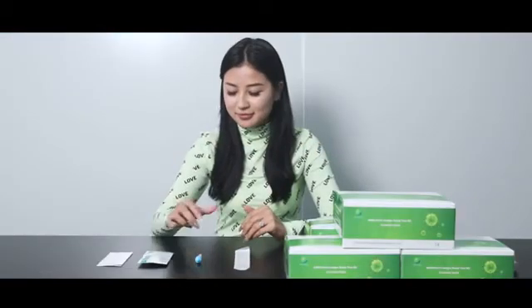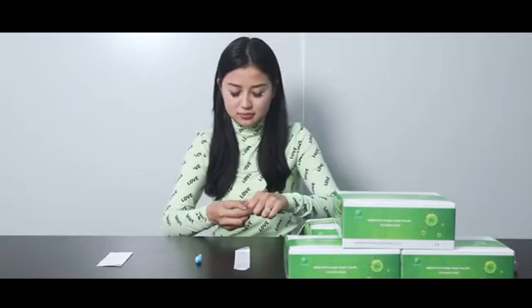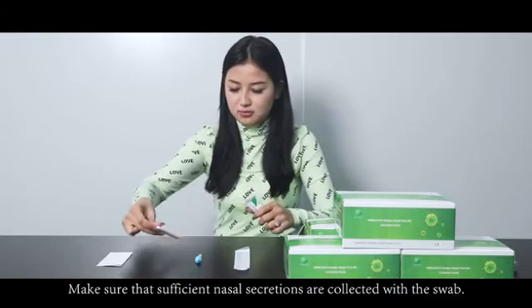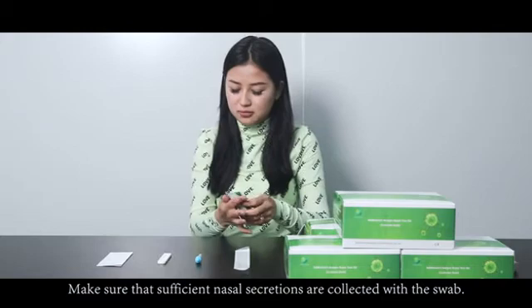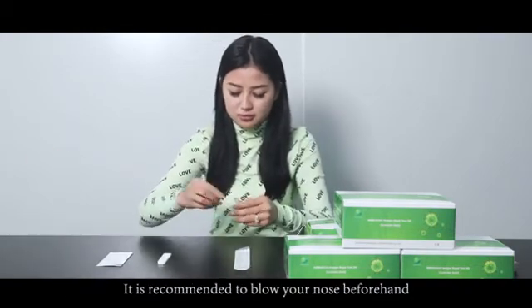Anterior nasal specimen collection. Read the manual carefully before use. Make sure sufficient nasal secretions are collected with the swab. It is recommended to blow your nose beforehand.